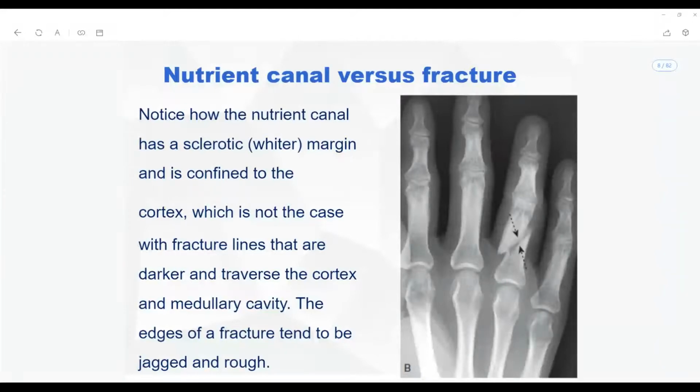Is Reshma here? Yes. Okay, can you tell me? Yesterday, I guess you are the one who was mistaken, right? Can you tell me which one? Is it the third, first, second, which one? Why is everybody saying third?